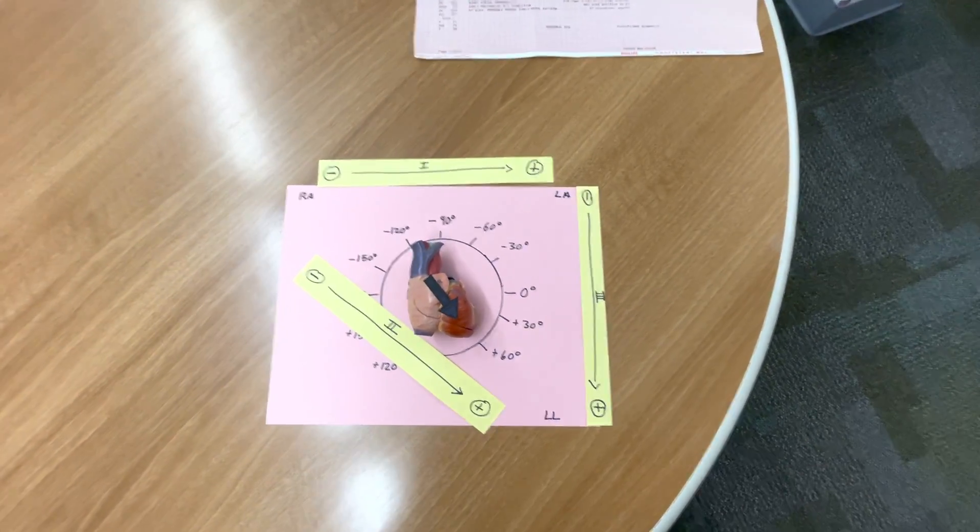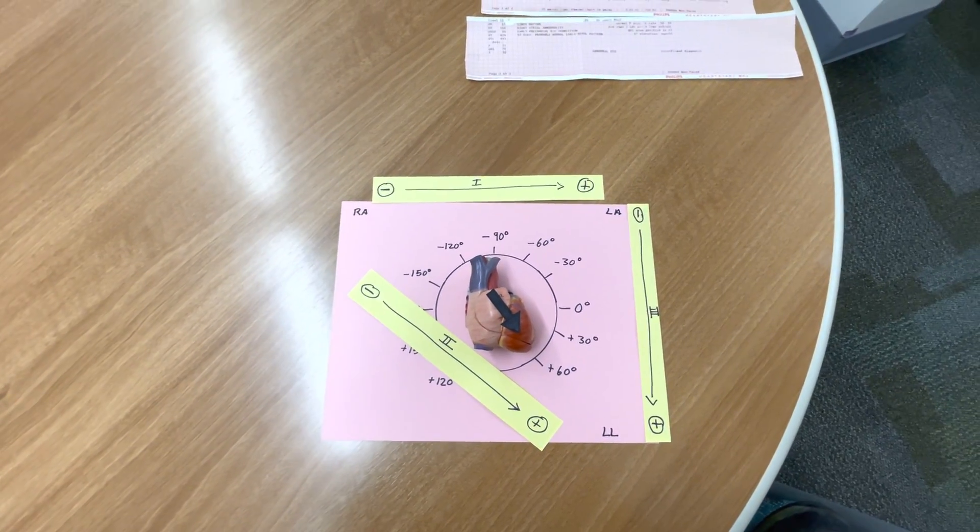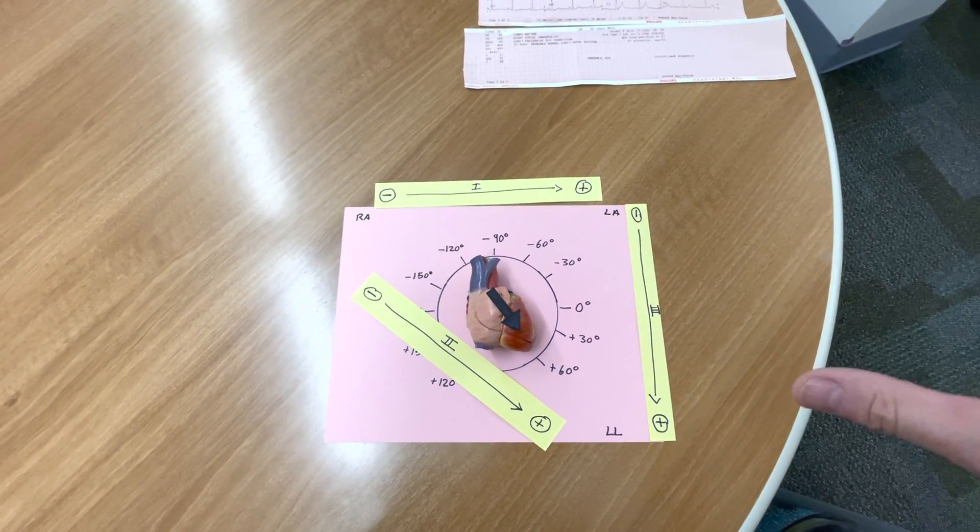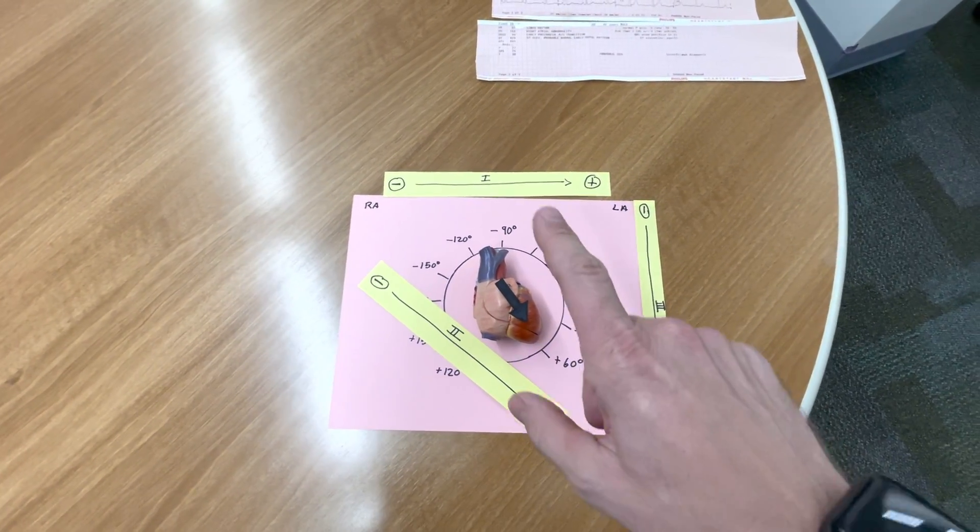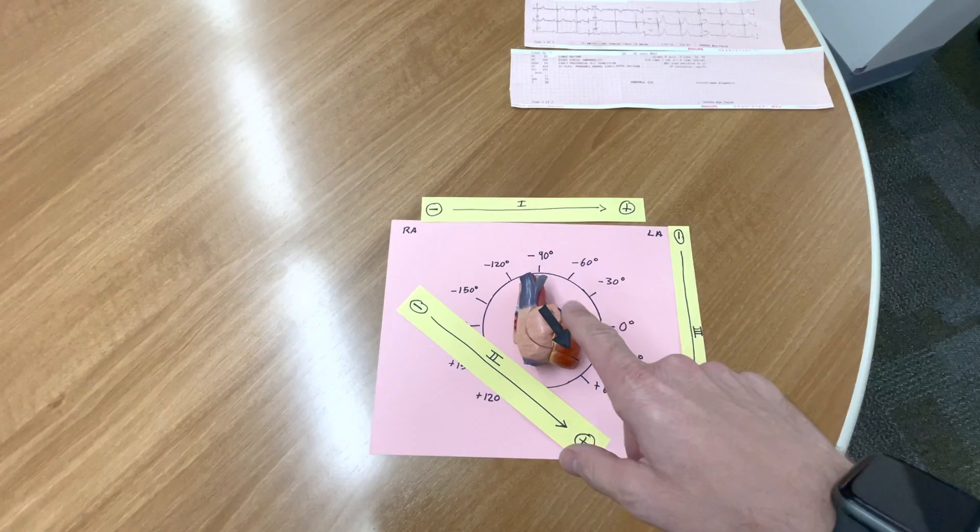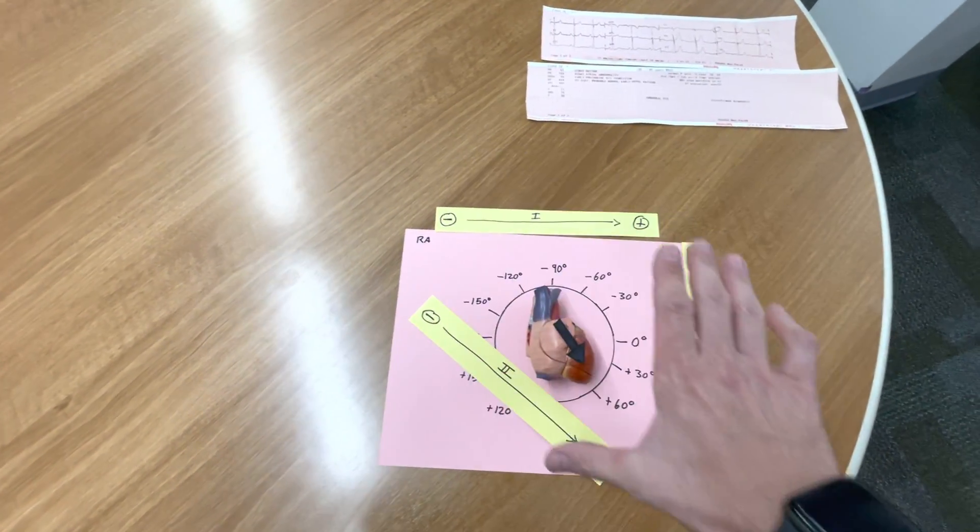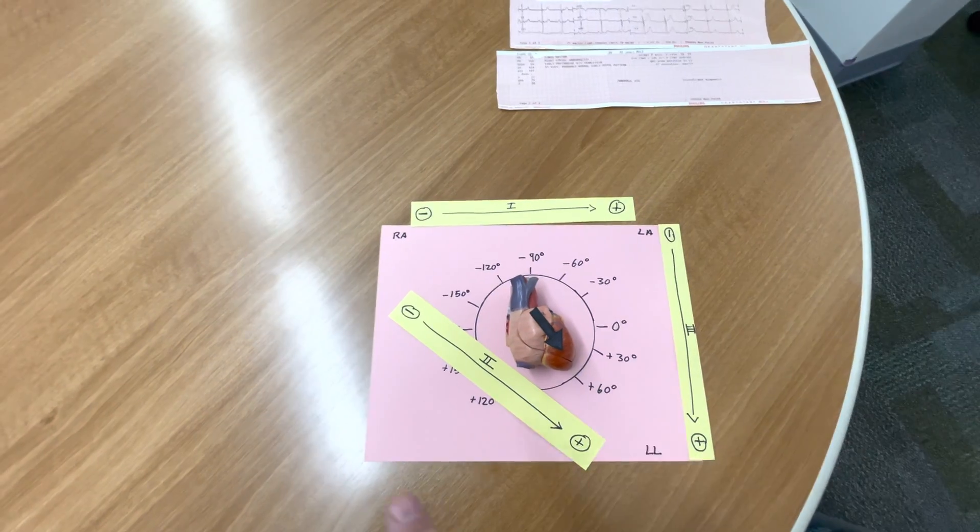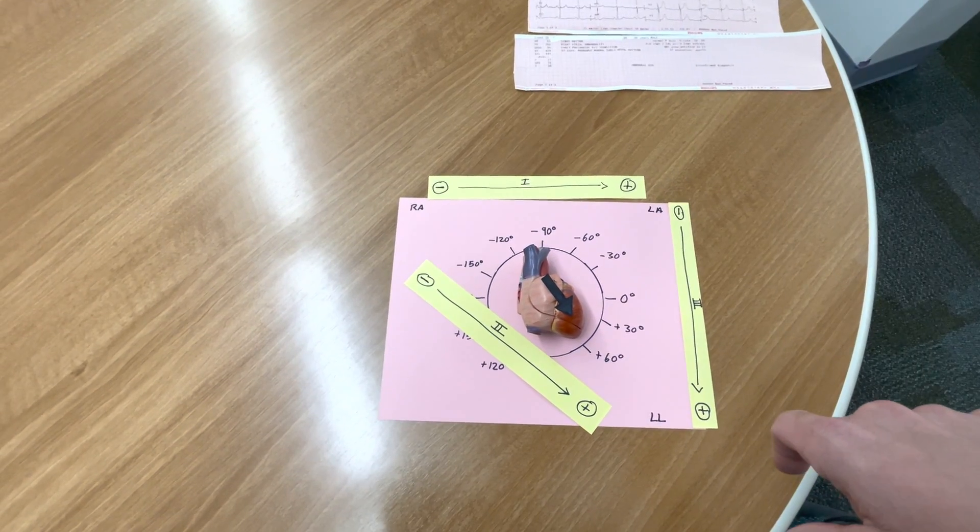Remember, the limb leads are bipolar, so you can look at them through multiple directions. A quick, easy way to determine if the axis is normal on a person is, if you look at the limb leads 1, 2, and 3, the electrical activity is more or less moving toward the positive electrodes in all three leads. The electrical activity is more or less moving in this direction, more or less moving toward the positive.